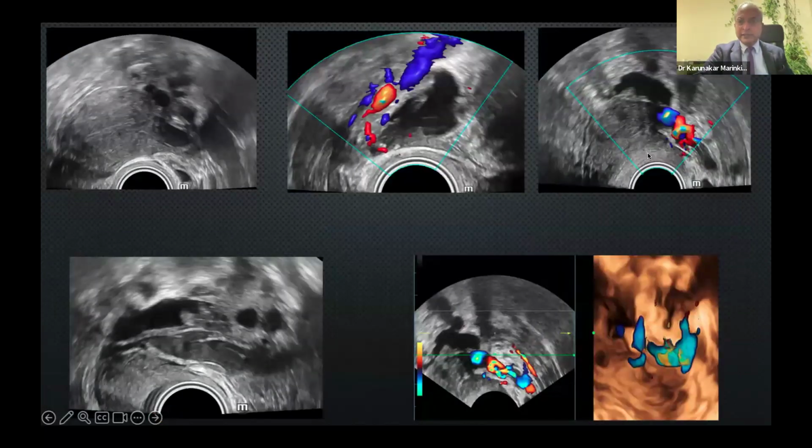So it's very scary sometimes when I don't even see what this structure is. There is an ovary, there are 2 follicles, there is a cystic collection, and there is something which is an avascular structure. I can always say whatever theoretically I can write. So please, these are the cases. You must do laparoscopy. And again, you need to be an expert in laparoscopy.